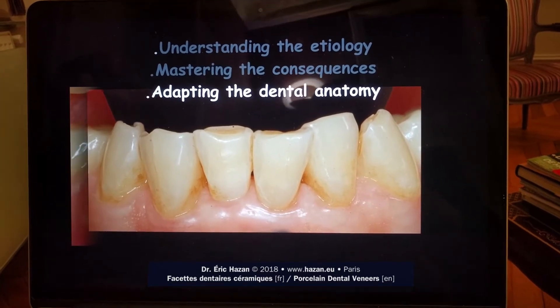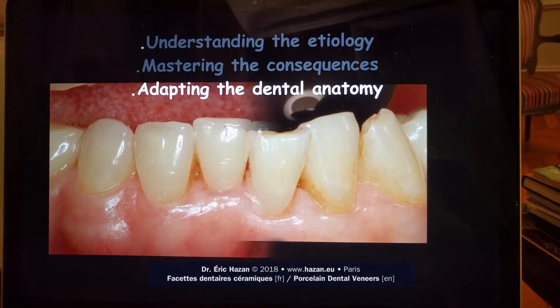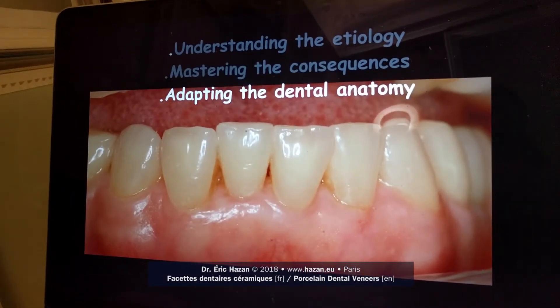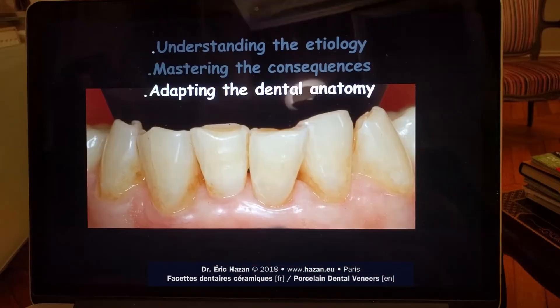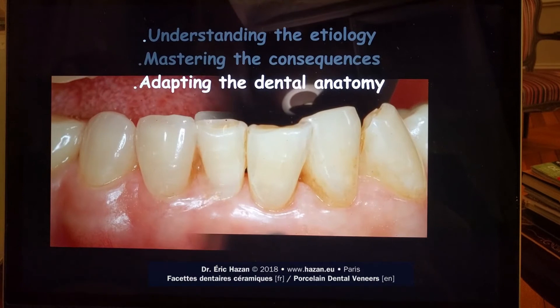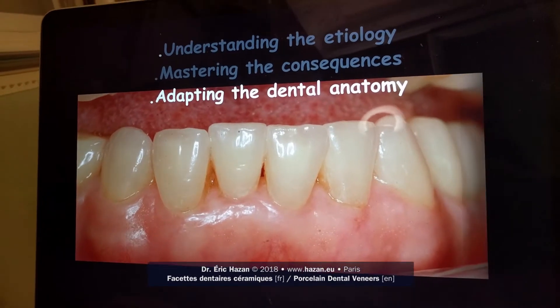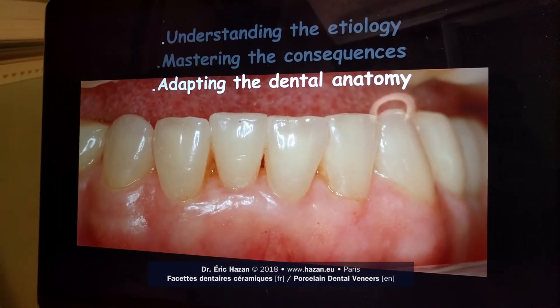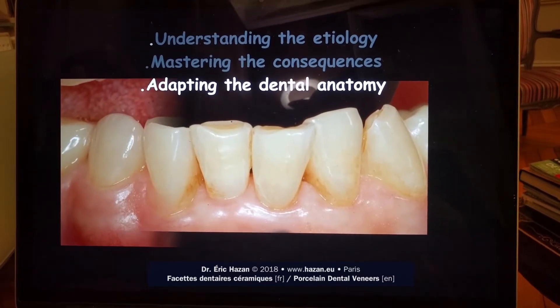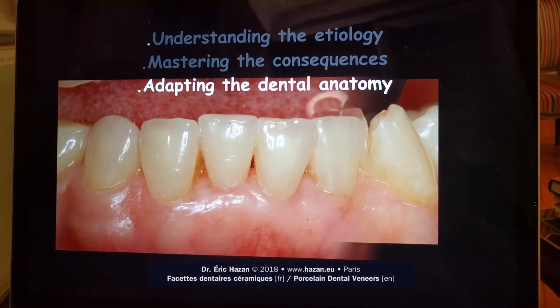We have a patient, she's 61 years old, and she has worn off her teeth pretty much, as you can see by looking at the level of the teeth on the occlusal surface — which is this part. You can see that there are wear facets that are very prominent on this patient, though not everywhere.